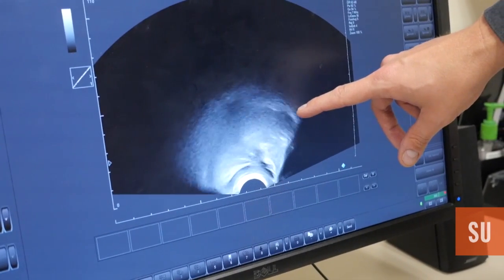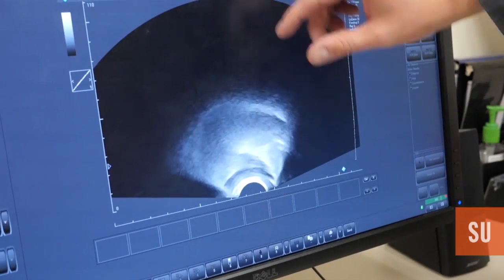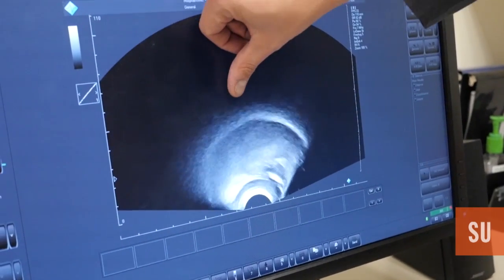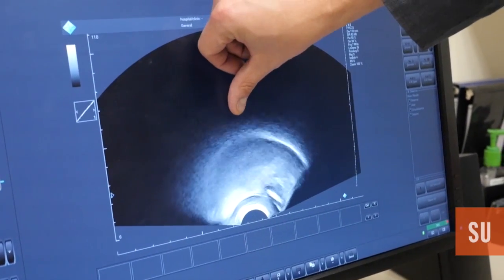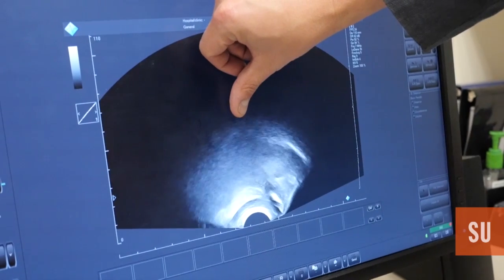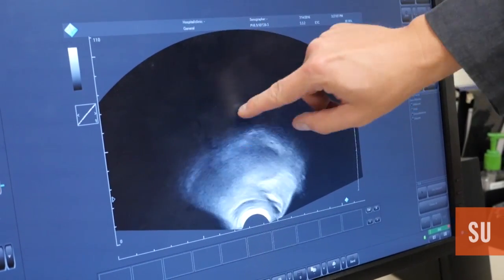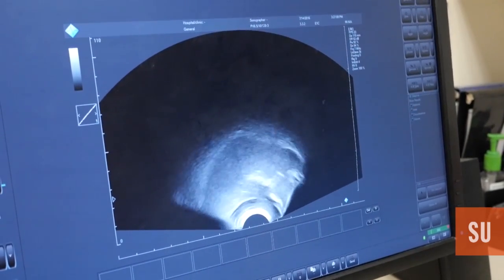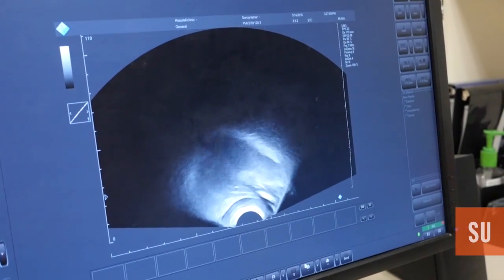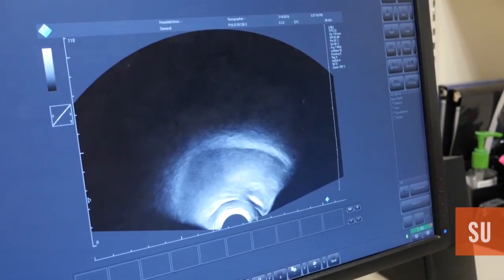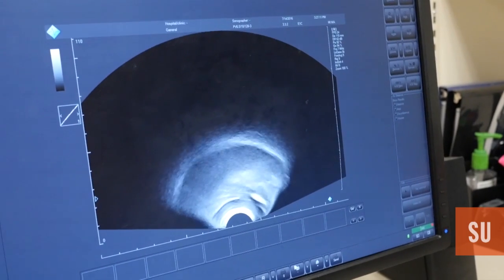This is me talking now with the ultrasound. There are sounds that we use the back of our tongue for — like 'get, get, get, get' — so you can see that part raising and lowering. The type of treatment we're doing now is for children who have articulation disorders.